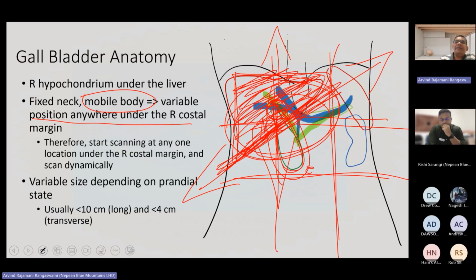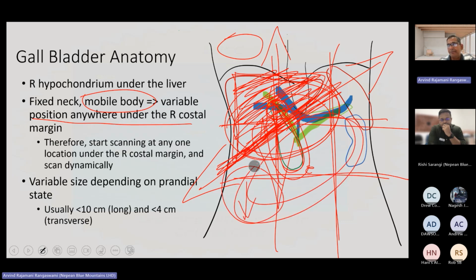The reasons might be that you are high up in the thorax, which means that you're going to get lung markings, or you're going to be somewhere inferior, somewhere here, or you're going to have crowded rib spaces which are causing acoustic shadows. Each of these will have its own characteristic pattern. If you have an A-line pattern or a lung marking pattern, then you have to move inferiorly.